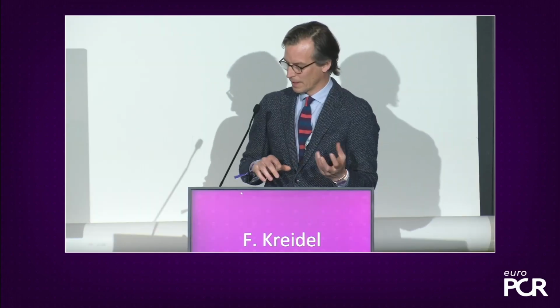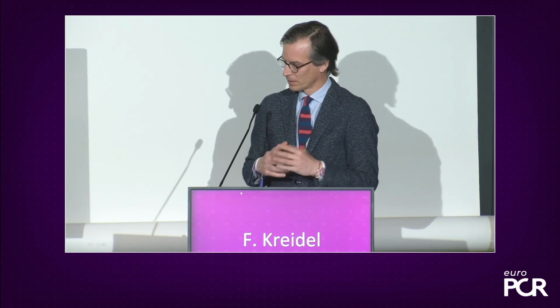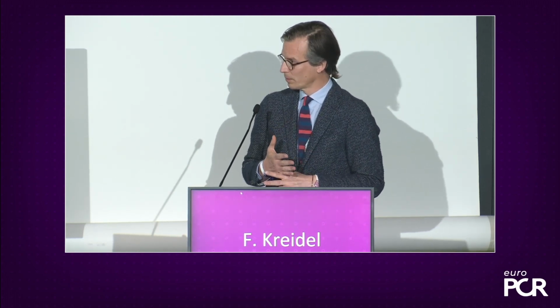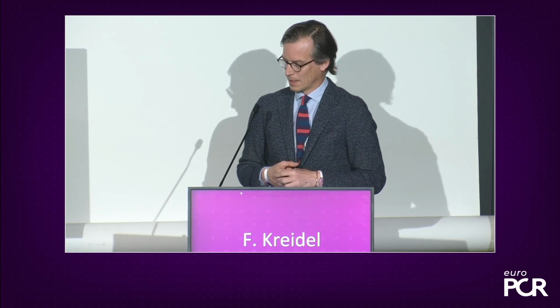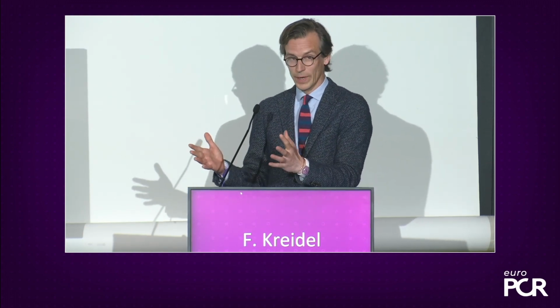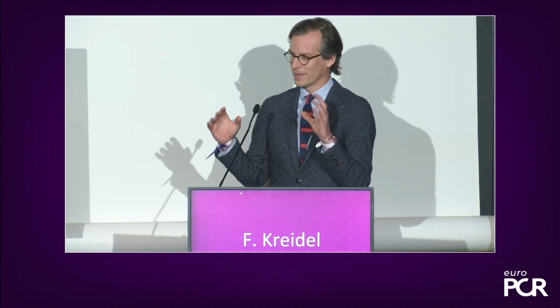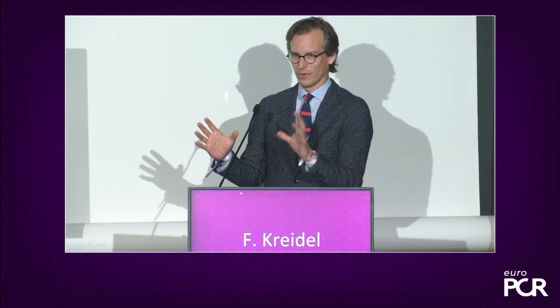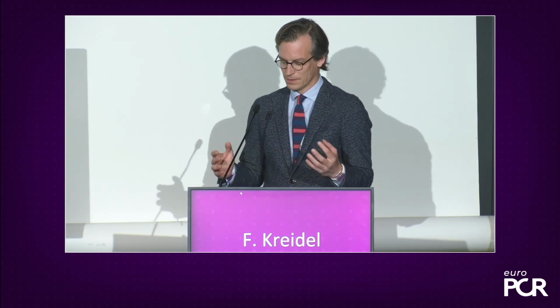Imagine 2D, you really have to get the probe around the heart, which is difficult, to get opposing or perpendicular imaging planes. And with 4D and multi-planar reconstruction, you're actually heading in the way probably many imagers dream of, that you find one dedicated position for your probe, create a 3D volume, and the rest is done electronically.